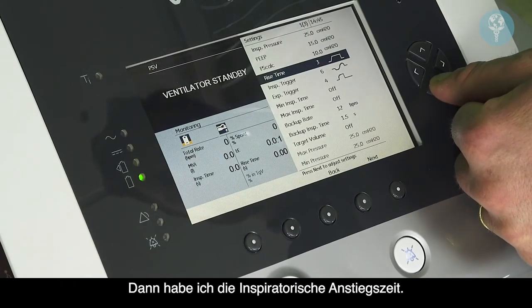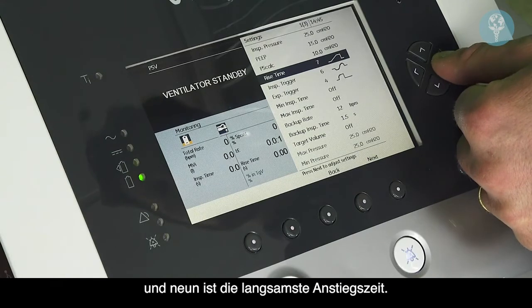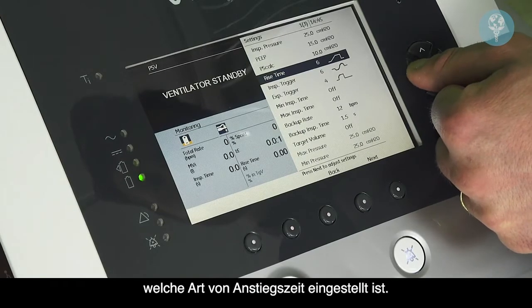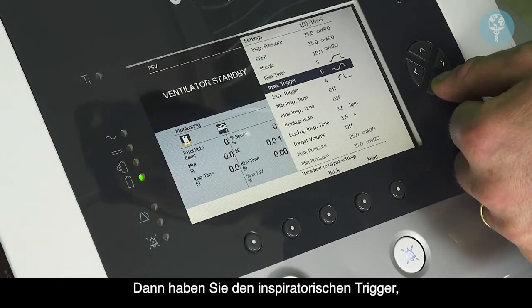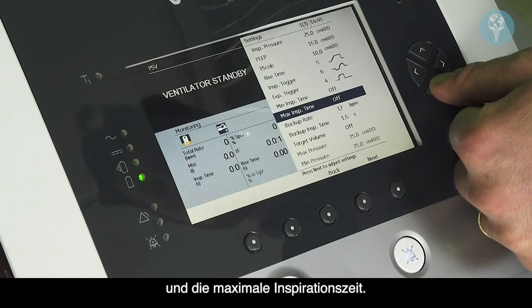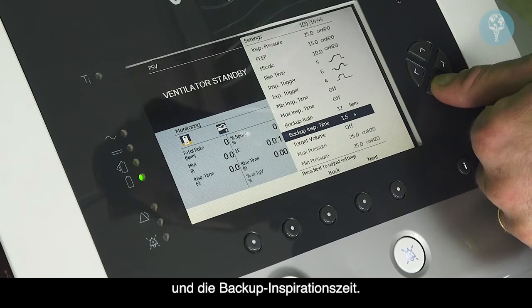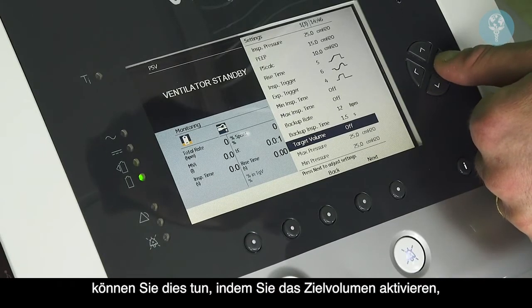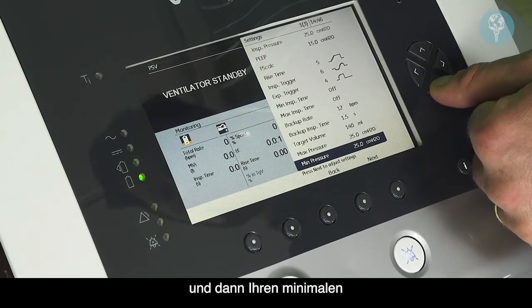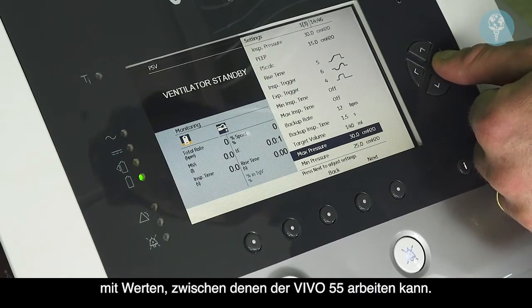Then I have the inspiratory rise time. So 1 is the fastest rise time and 9 is the slowest rise time. And you can see from the shape of the flow curve that's shown on the screen there what sort of rise time you're getting. You then have your inspiratory trigger, your expiratory trigger, your minimum inspiratory time, maximum inspiratory time, your breathing backup rate for the patient, their backup inspiratory time, and then if you want to set a target volume, you can do so by activating the target volume, and then you can set your minimum and maximum inspiratory pressure that the Vivo 55 can operate between.